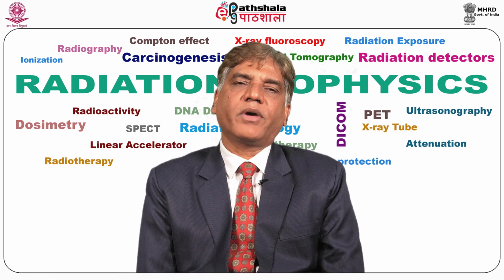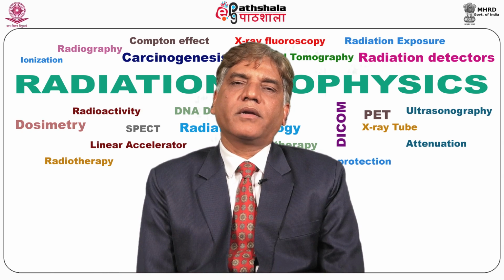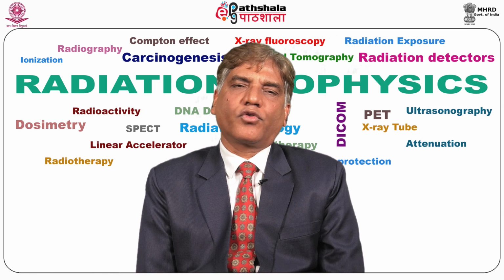During scanning, some energy is absorbed at F centers, and thus electrons get this energy. A fraction of electrons gain enough energy to reach the conduction band and become mobile, and then drop back to the ground state, to the valence band, and emit light. That means trivalent europium is converted back to divalent europium. Emission of blue light is radiated in the form of light which is detected by the photomultiplier tube.